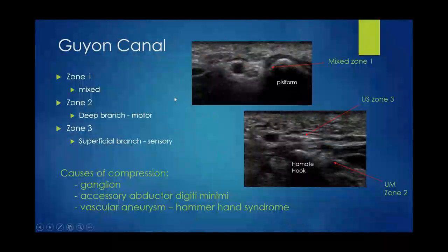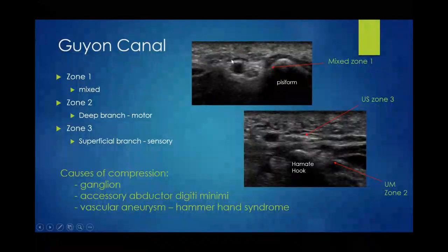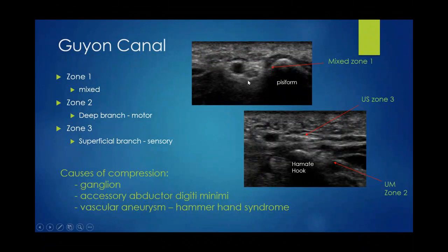Moving on to the ulnar neurovascular structures, they live within Guyon's canal in the wrist. That canal is formed by the pisiform proximally and the hook of the hamate distally. The roof is formed by the palmar carpal ligament. The floor is the extension of the transverse carpal ligament. The ulnar artery lies radial with the ulnar nerve ulnar to that.